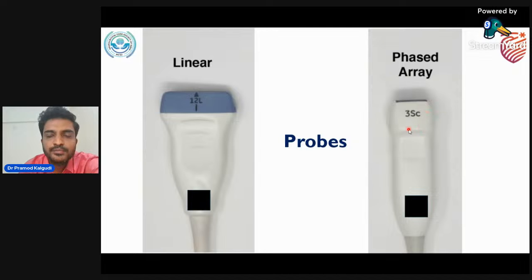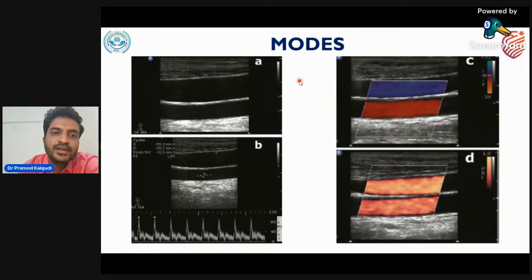So the phased array probe frequency generally falls between the curvilinear and the linear probe. This makes it a better probe for most things, because it has the feature of a lower frequency to penetrate deeper, and also a bit of the higher frequency to delineate more clearly. So this makes it the best probe for your transcranial color coded duplex Doppler, TCCD.